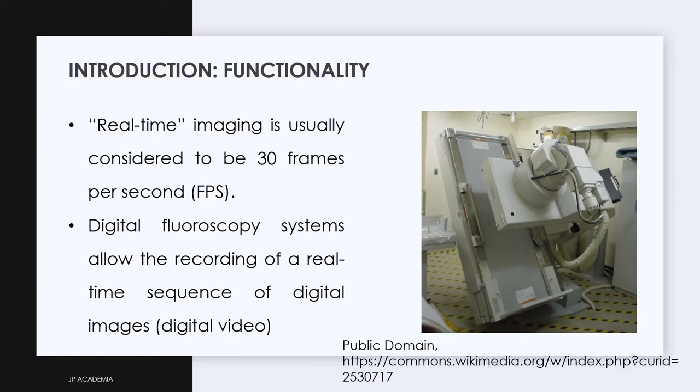Digital fluoroscopy systems allowed the recording of a real-time sequence of digital images or digital video that can be played back as a movie loop with subsequent archiving in the patient's electronic file in the Picture Archiving and Communication System, or the PACS.